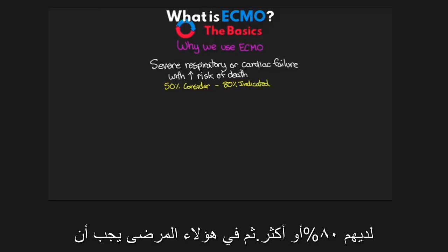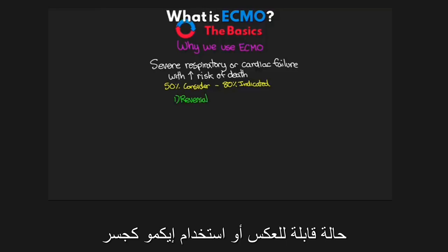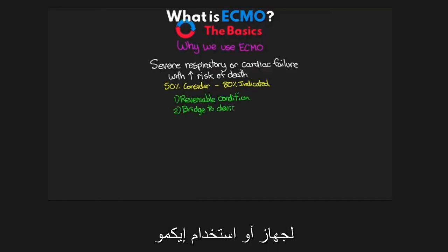And then in these patients, one of three different situations has to exist. It has to either be a reversible condition, or using ECMO as a bridge to a device, or to use ECMO as a bridge to transplant.